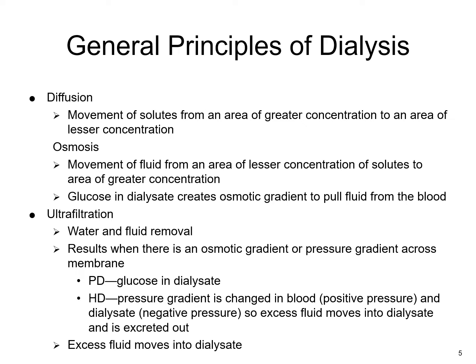So I actually adjusted this slide a little bit so that it would flow better with audio. So these are the general principles of dialysis. You're getting diffusion, which is movement of solutes from an area of greater concentration to an area of lesser concentration.